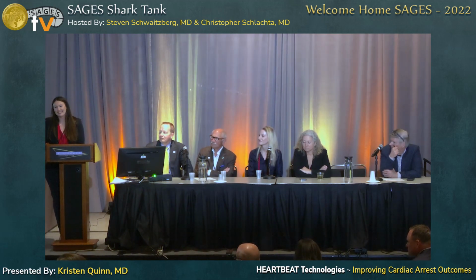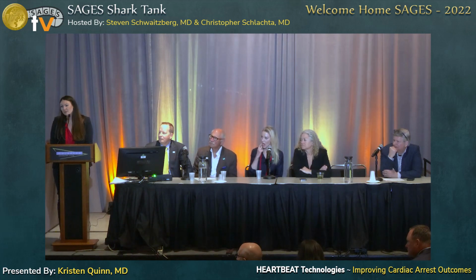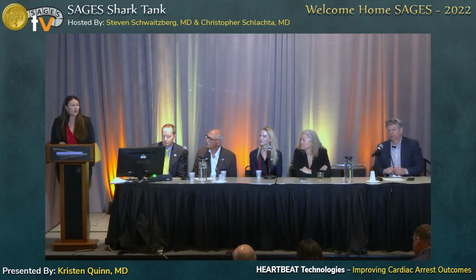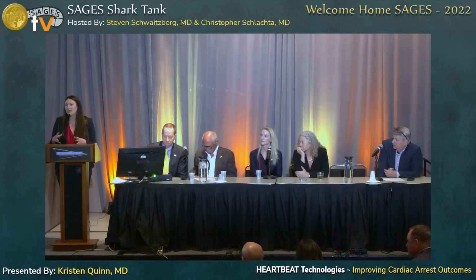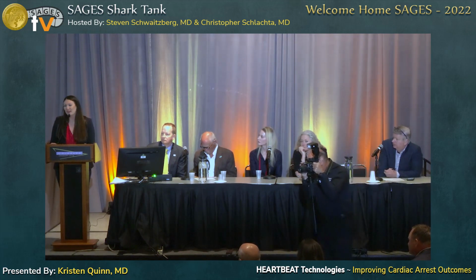Hi, my name is Corina de Reuter. I work at Intuitive, but I really like your part. But can you tell me what's the difference between your device versus putting 2 blood pressure devices on your leg? Yeah, that's a great question, and it all comes down to usability. Some of the testing that we'll be doing is seeing how long it takes people to put on and how rapid you can get it to deploy. We're going to be using compressed air CO2 cartridges to get that extremely rapid inflation of the pneumatic bulbs, versus a normal tourniquet, which is not going to provide that.